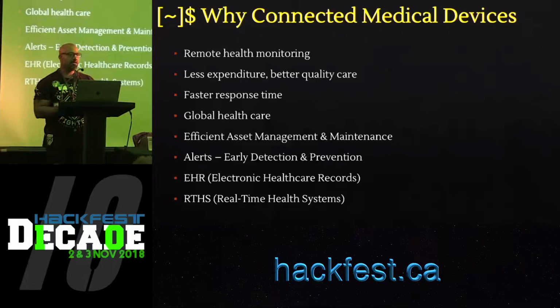And the older operating systems which were running on these medical devices did not have an endpoint solution on the devices. So it was able to compromise tons of medical devices and then use the compromised devices to pivot and compromise further systems. So I think it used Citadel and Zeus malware for horizontal movement and compromised other systems on the hospital network.